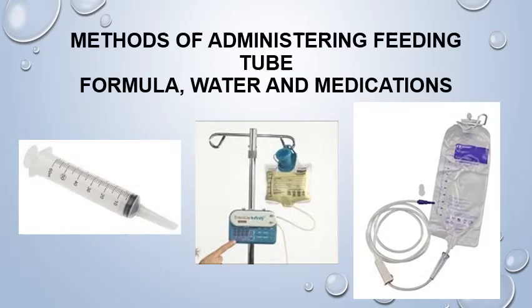There are 4 different methods of administering feeding tube formula, water, and medications. This is prescribed by the physician and delegated by the delegating licensed nurse. The most common methods include syringe bolus feeding, intermittent gravity tube feeding, continuous gravity tube feeding, and a pump feeding.